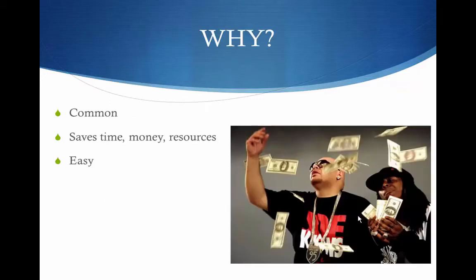So why do we care? DVT is a common thing, right? It affects a wide range of medical and surgical patients, and it's very commonly on our differential diagnosis. By doing this quickly at the bedside, we can save time, money, and resources, and as you're going to see, this is really easy. You can do this.